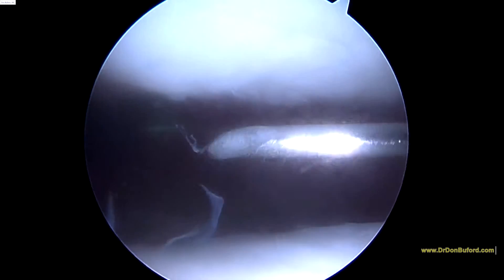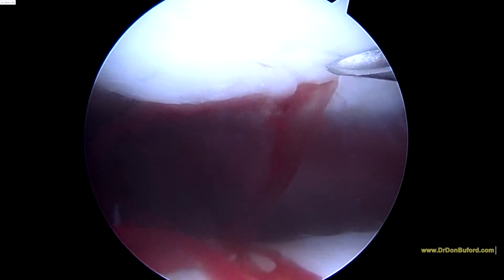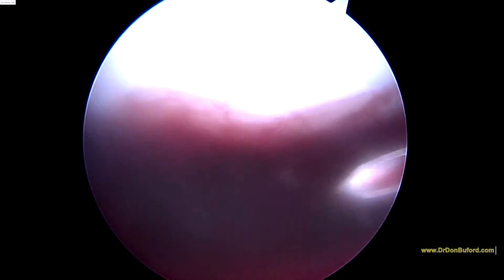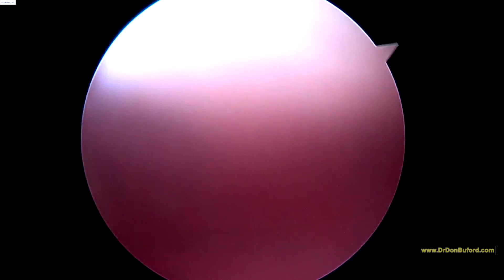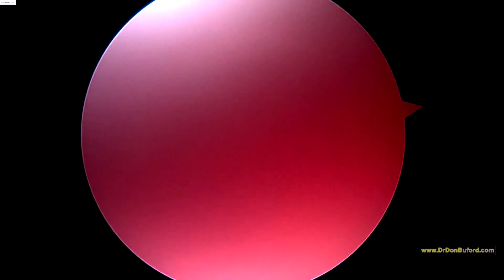I just want to show you — here we are putting in the stem cell injection. There's the needle. Okay, so that's it. Now that we've done that, it's going to be really hard to see, so we'll go ahead and sign off. Hopefully this will do the trick for you. Good luck to you now. Bye-bye.